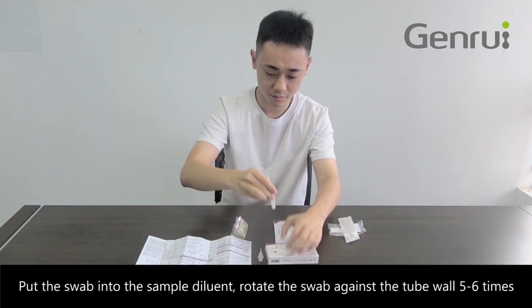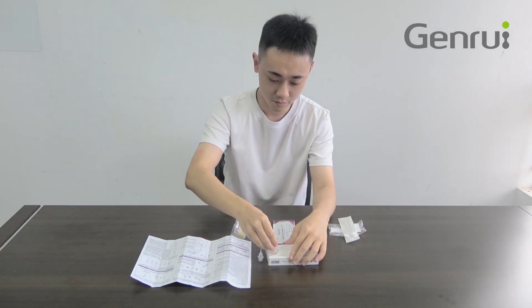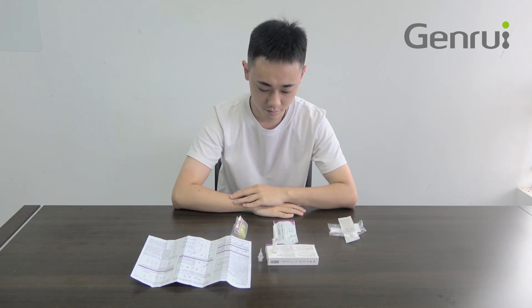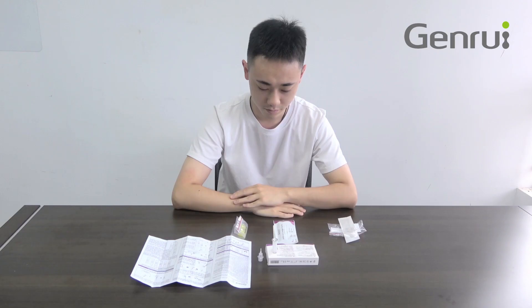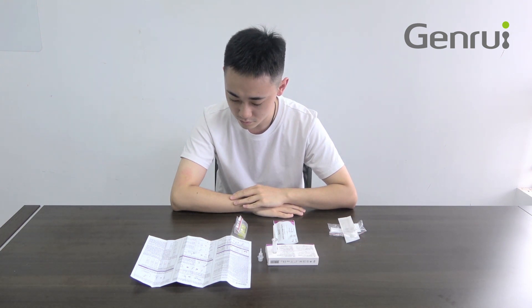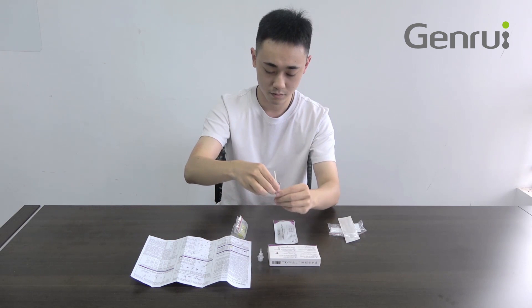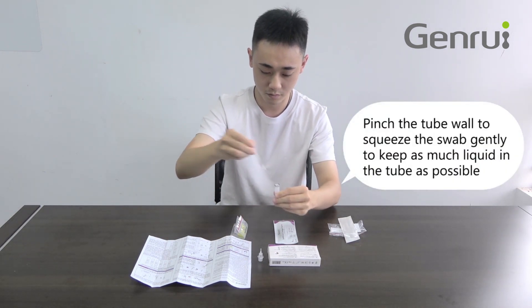Put the swab into the sample diluent and rotate the swab against the tube wall 5 to 6 times. Let it stand for 1 minute.